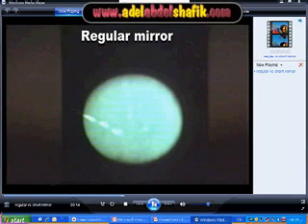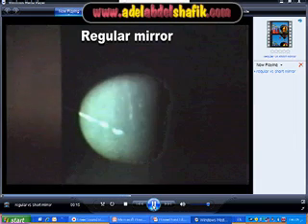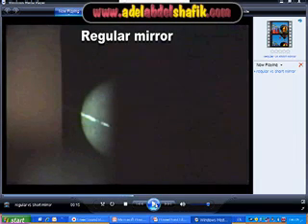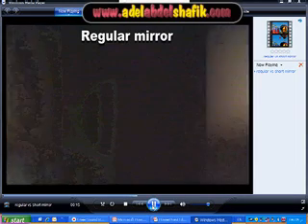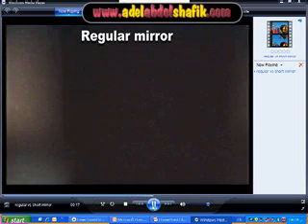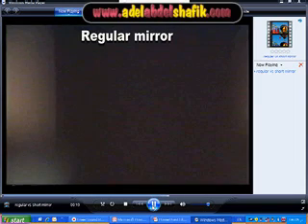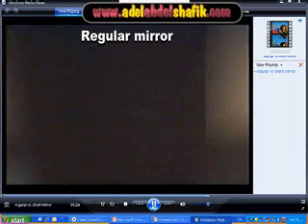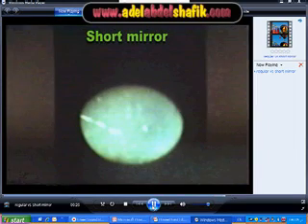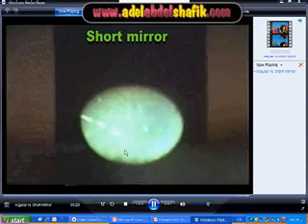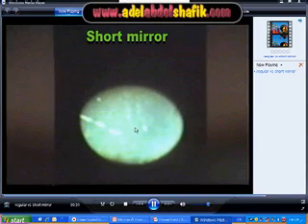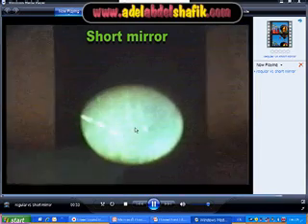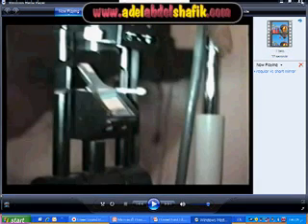Here the video camera is on the eyepiece. With the regular mirror end-on to the microscope, you don't see the light itself. But if you replace the regular mirror with the short mirror, you can get the light end-on, your line of vision becomes visible, and you can still see the posterior segment.